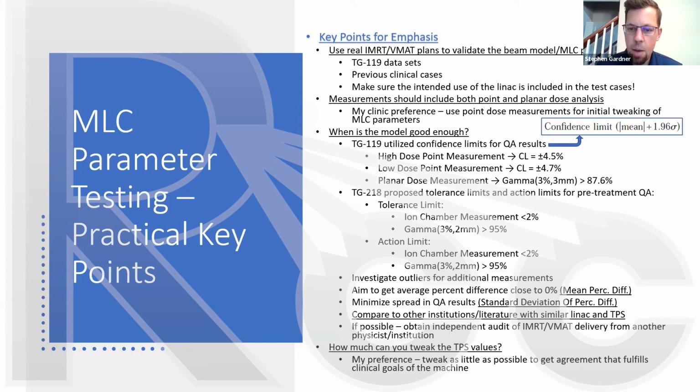And then, how much can you tweak the treatment planning system values? My preference, my opinion, and my experience: tweak as little as possible so that you can get the agreement that fulfills the clinical goals of the machine. That's just my preference. I can go into that a little bit more, but that's how I treat it.